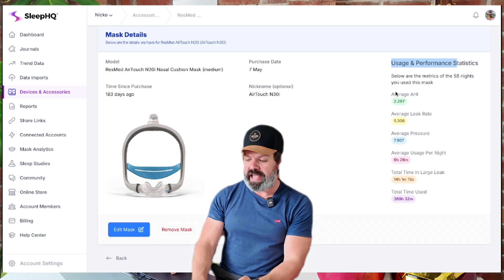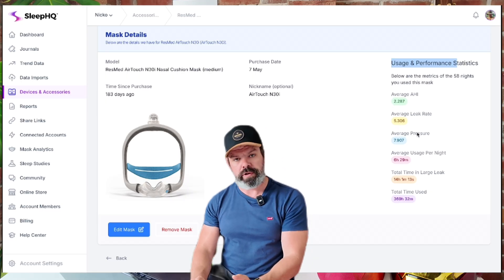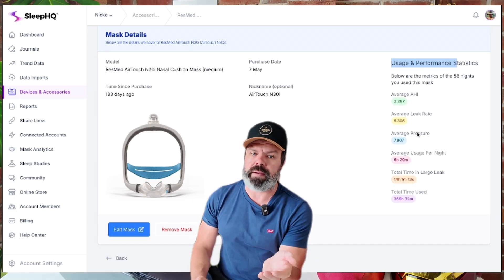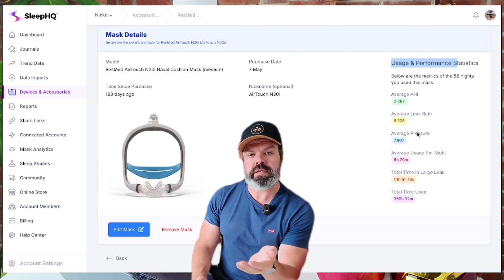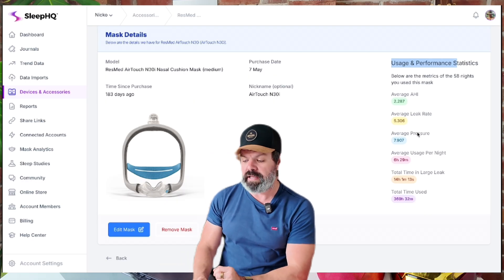I've got average AHI, average leak rate, average pressure, and so on. So if you have multiple CPAP masks that you're using, you can compare the performance right here.